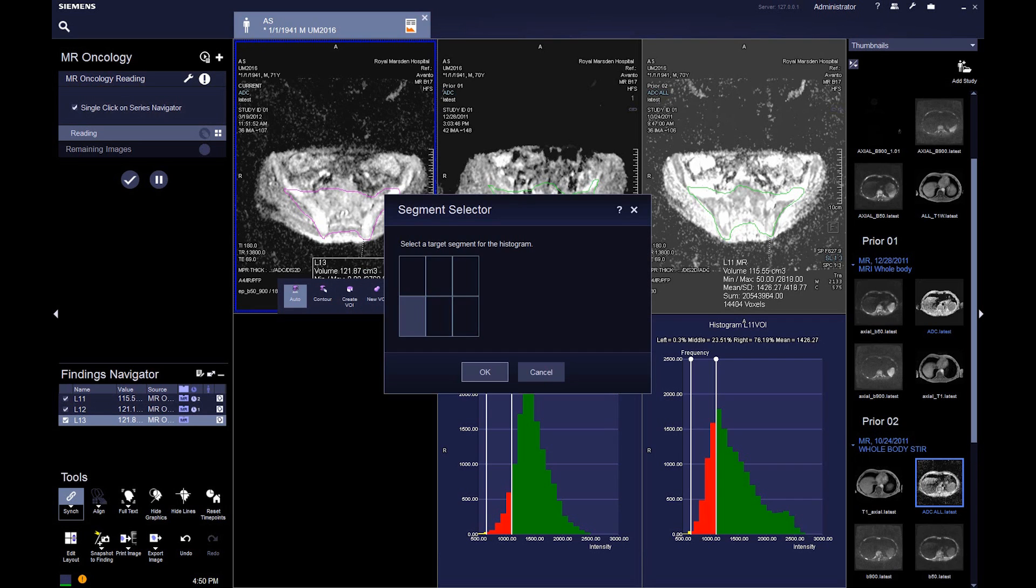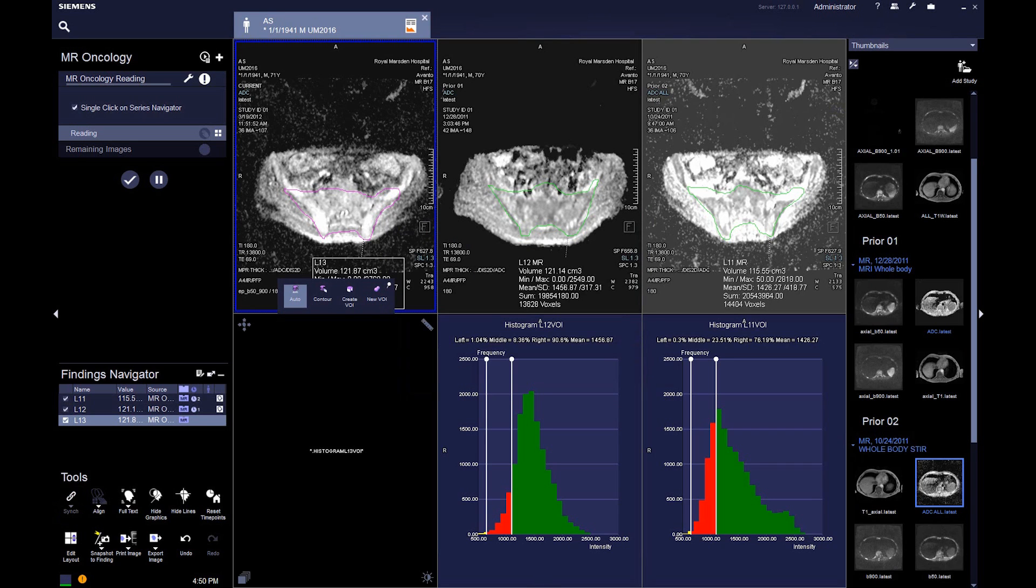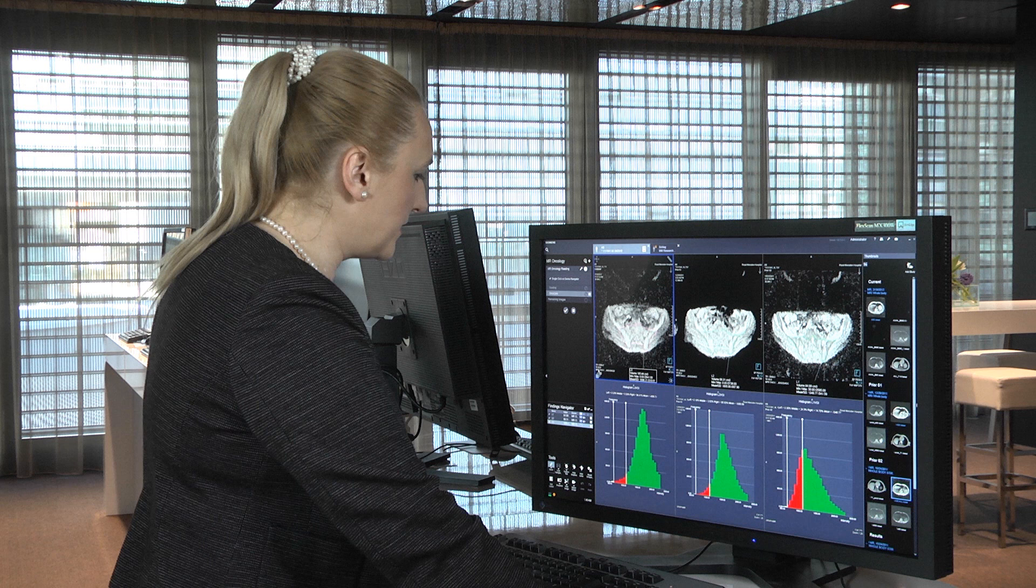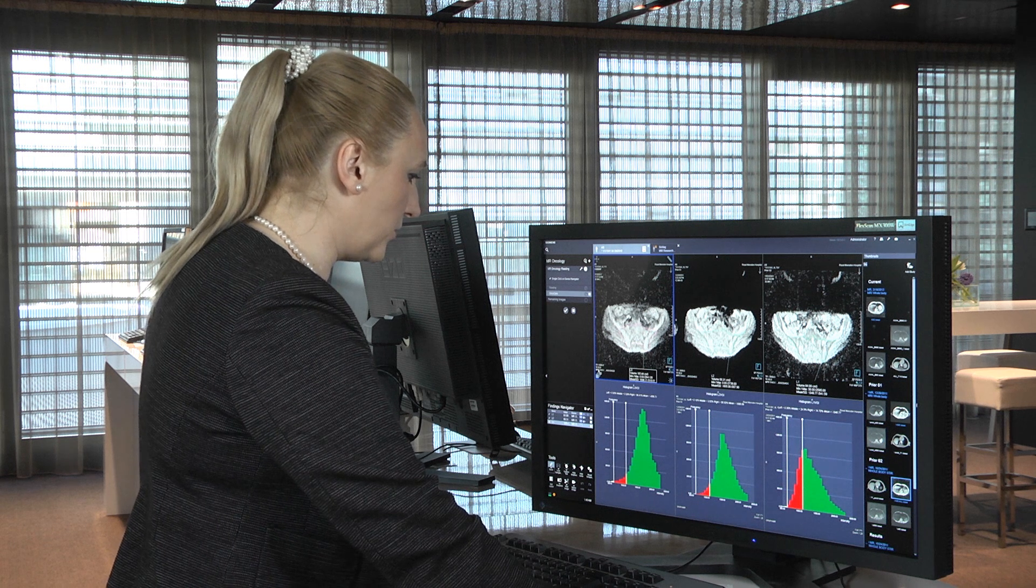We can choose where we want to do it. The MPR thick allows you to do these assessments in sagittal, axial, or coronal views.